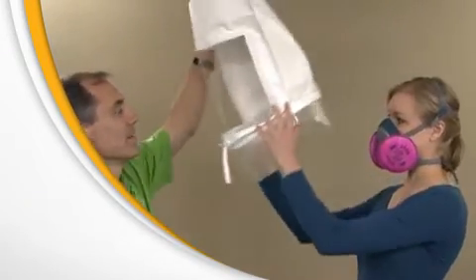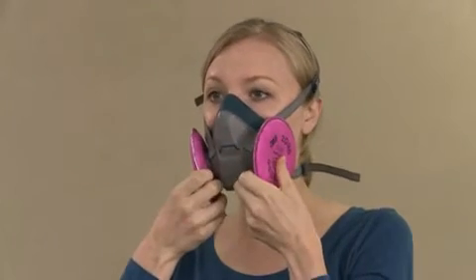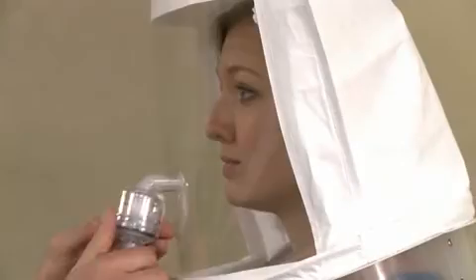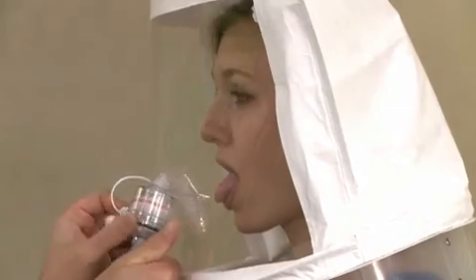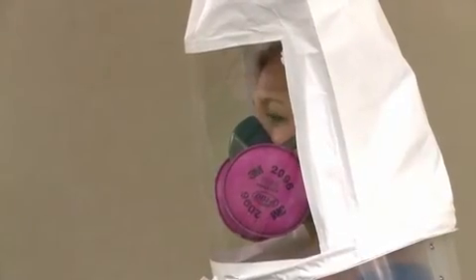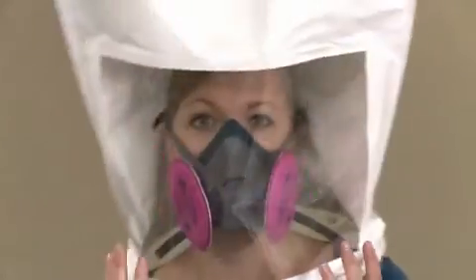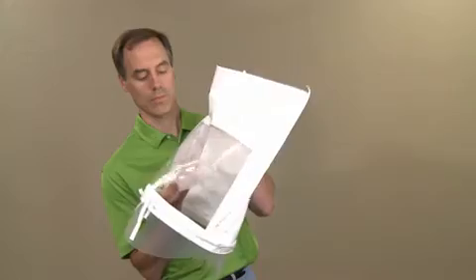If at any time during the fit test you detect the same taste you did during the sensitivity check, inform the instructor immediately — it means that your respirator does not fit properly. You must then refit your existing respirator or select a different size or style of respirator. Once you clear the taste of the test agent from your mouth, you'll repeat the sensitivity test and fit test procedure. If you complete the exercises without tasting the test agent, the respirator fits you properly and you passed the fit test. After the fit test is complete, the hood will be cleaned with a disposable wipe.